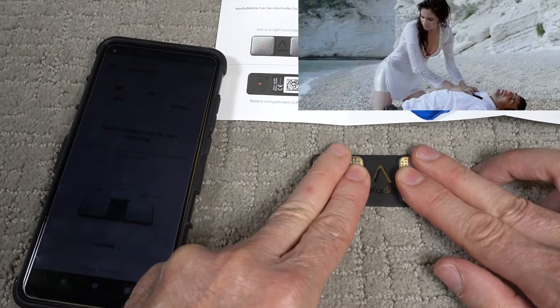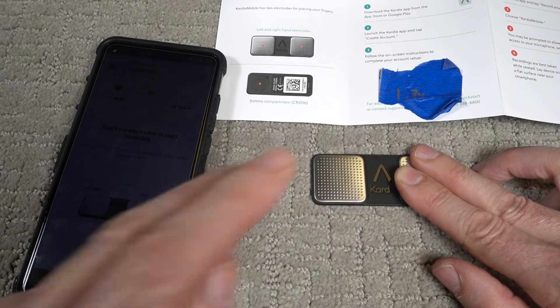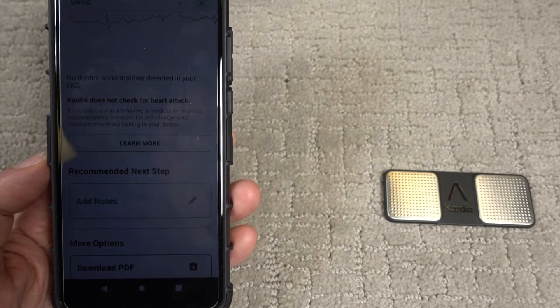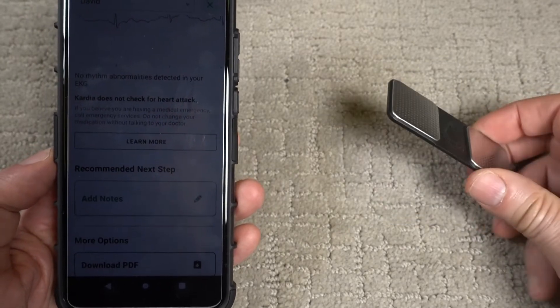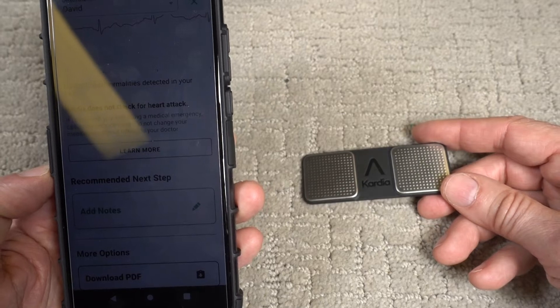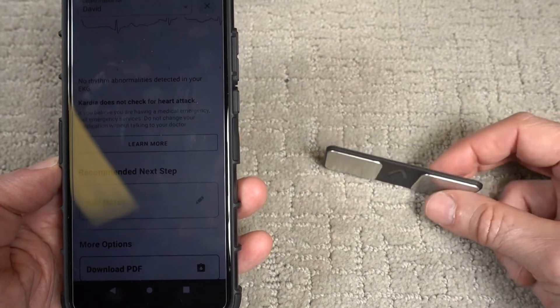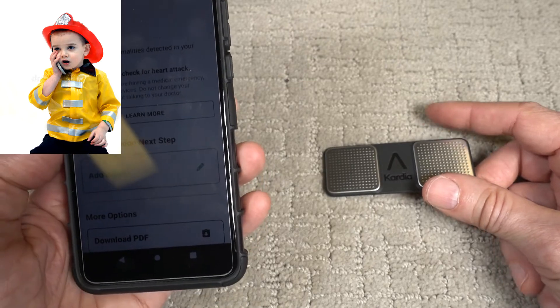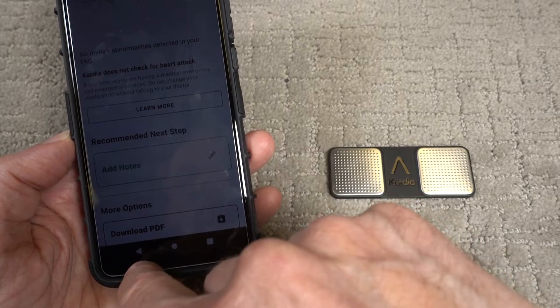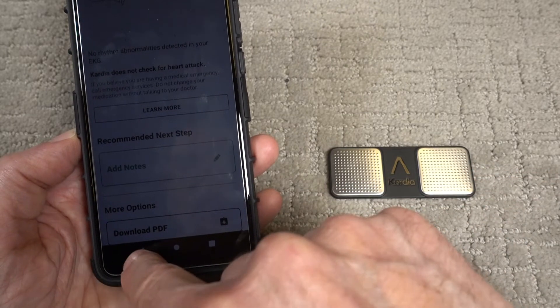I hope my heart didn't stop. I'm going to click on need help. Just tried it again off camera — I rocked back, sat down, and held this close to the phone. You have to be within six inches. It gave me a recording. It said there are no rhythm abnormalities detected, but it also says Cardia does not check for heart attacks, so if you're ever experiencing problems, make sure you call 911. I also downloaded the PDF to my Google Drive so I could send it to my doctor.